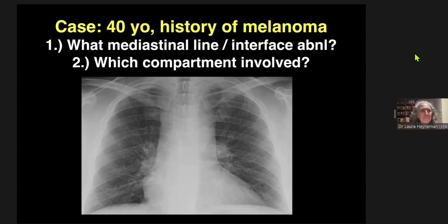I'll also just say that we will be talking about the cervicothoracic sign in a bit. So we'll have more about that in a minute.